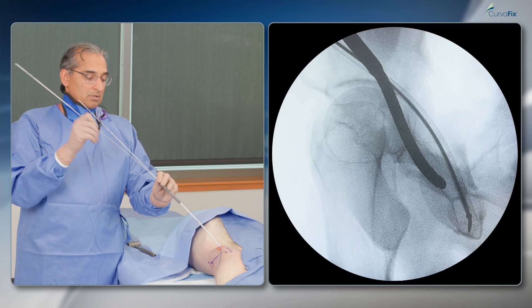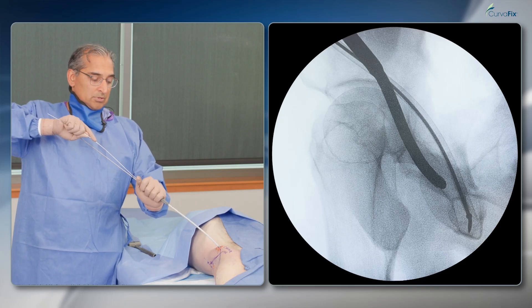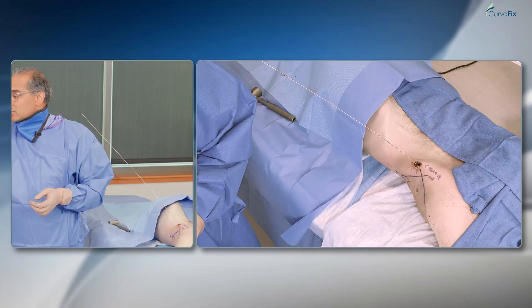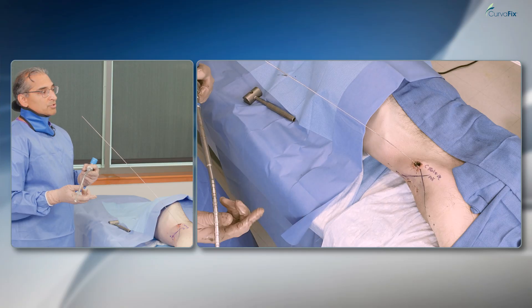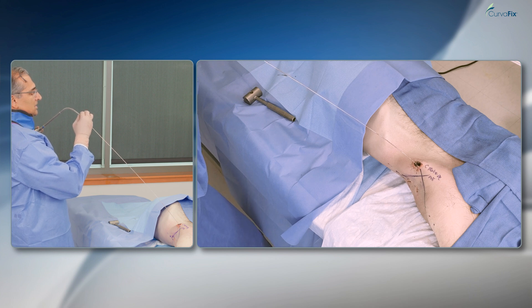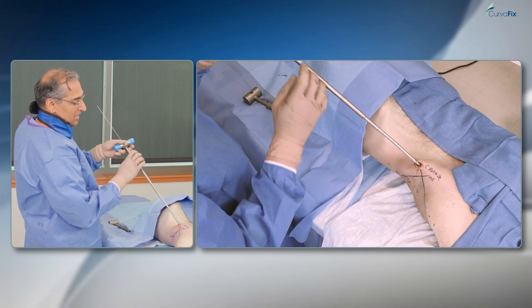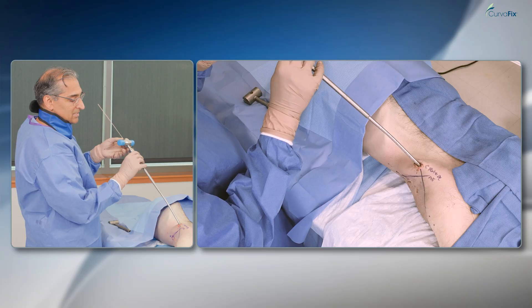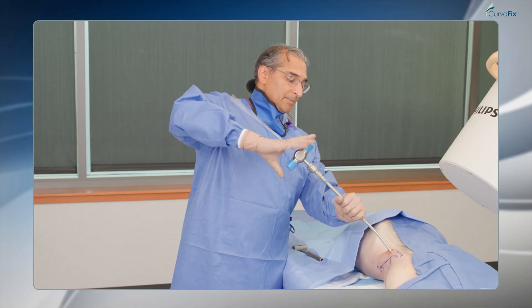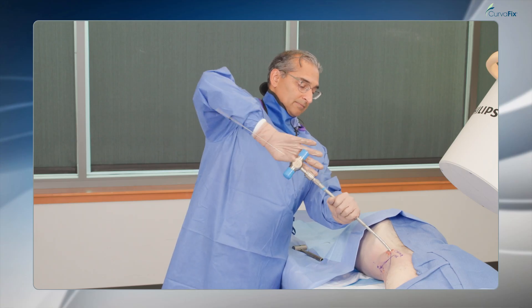I'll slide my exchange wire in and then remove the tube and the other wire simultaneously. For this screw I'm not using a washer — I don't want the screw head to be proud. In this part of the anatomy there's typically not a lot of soft tissue, and patients can sometimes feel the screw head. The previous screw design required countersinking, but this design has a flat head and does not have the same issues. This is a 9.5 millimeter screw going down the posterior column, which can oftentimes accept a screw of this size.